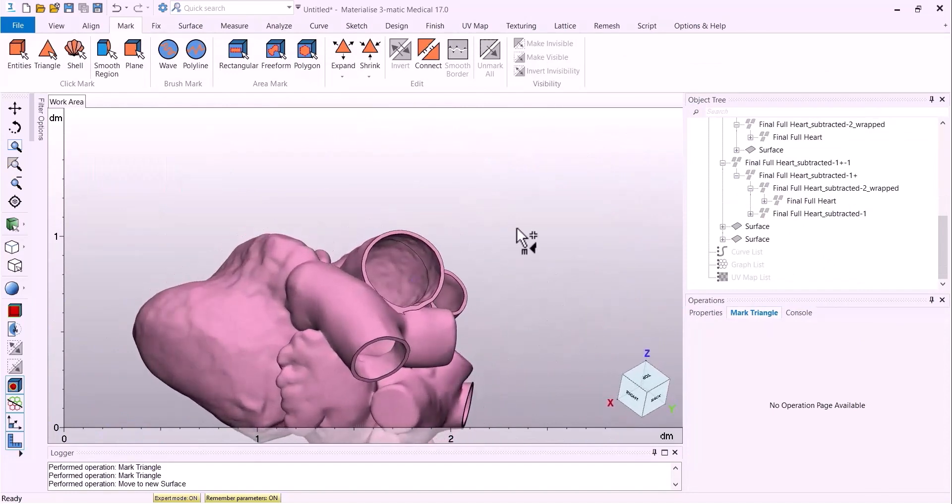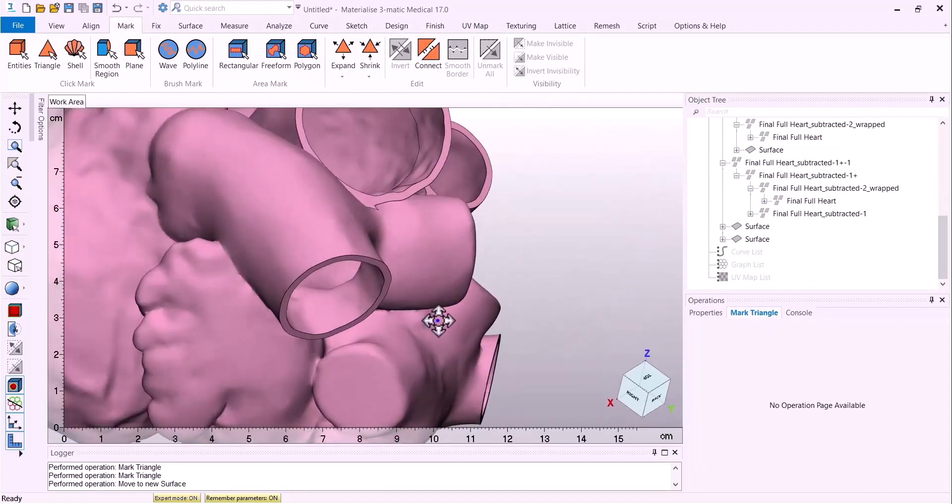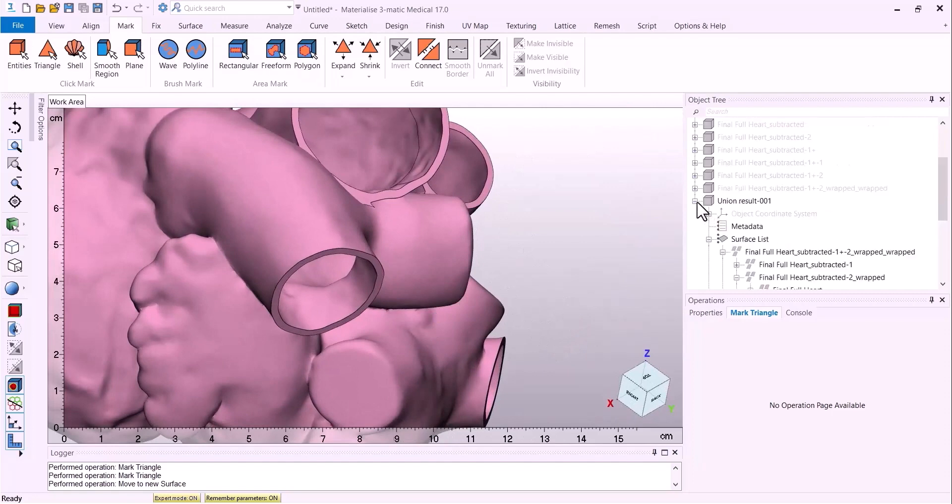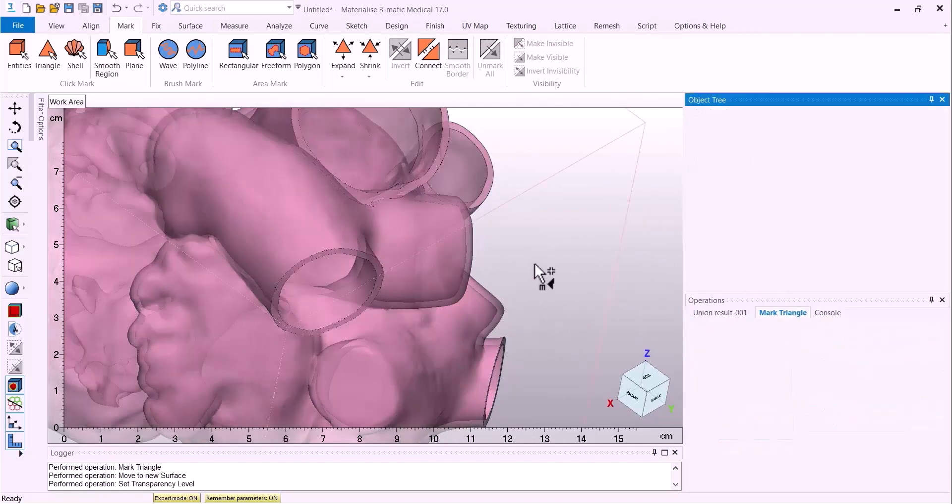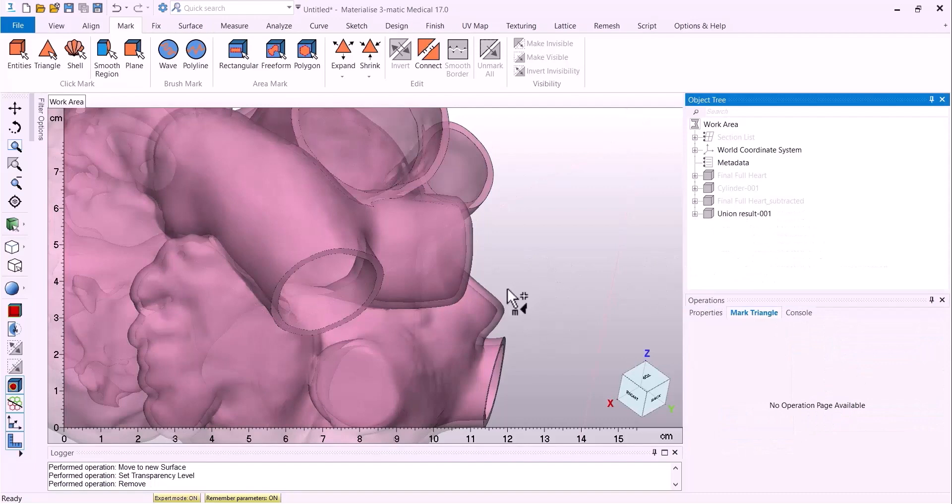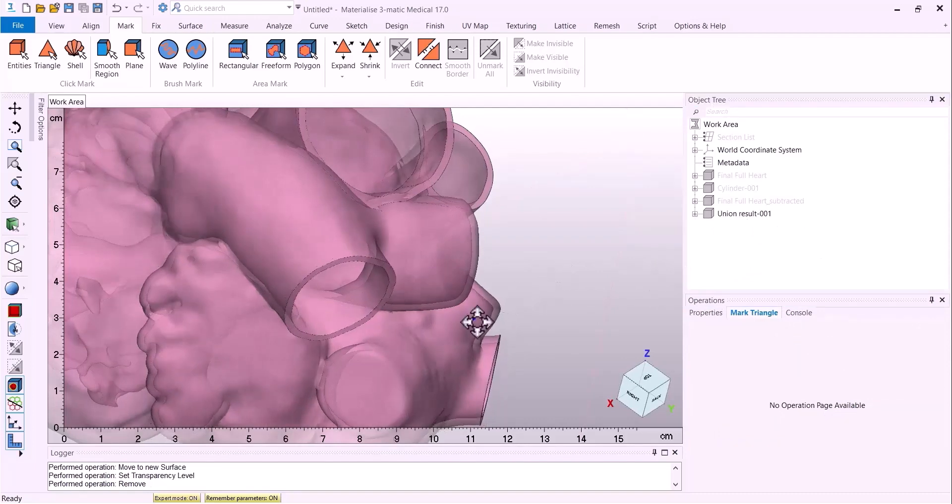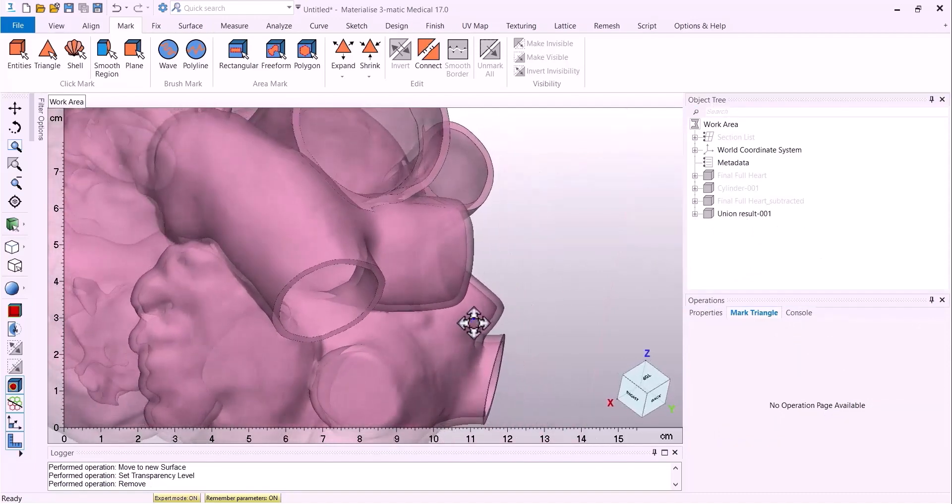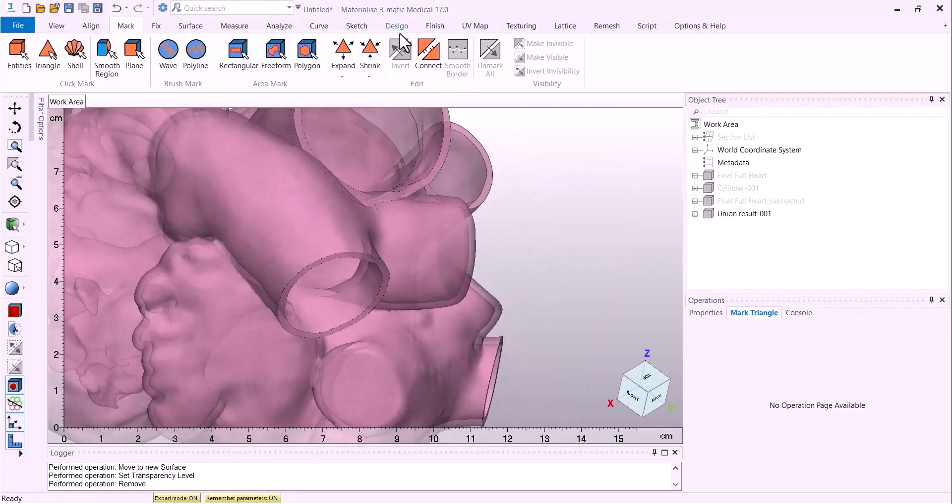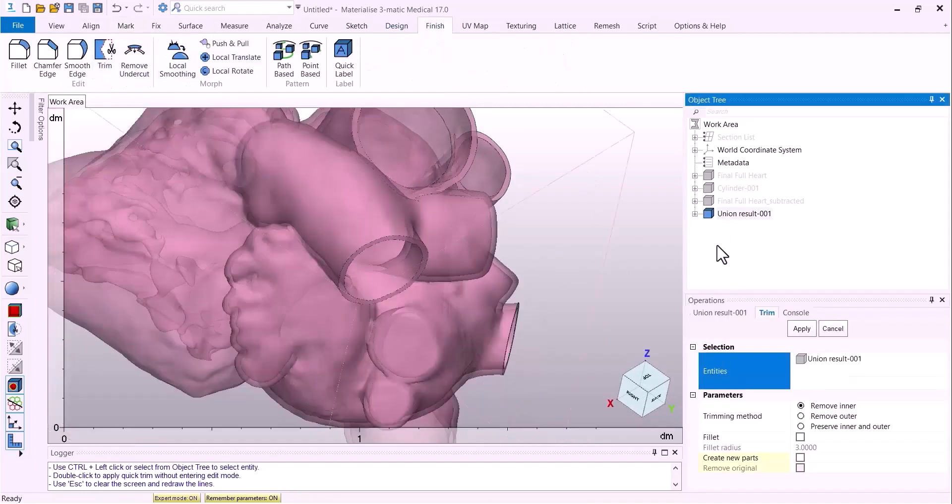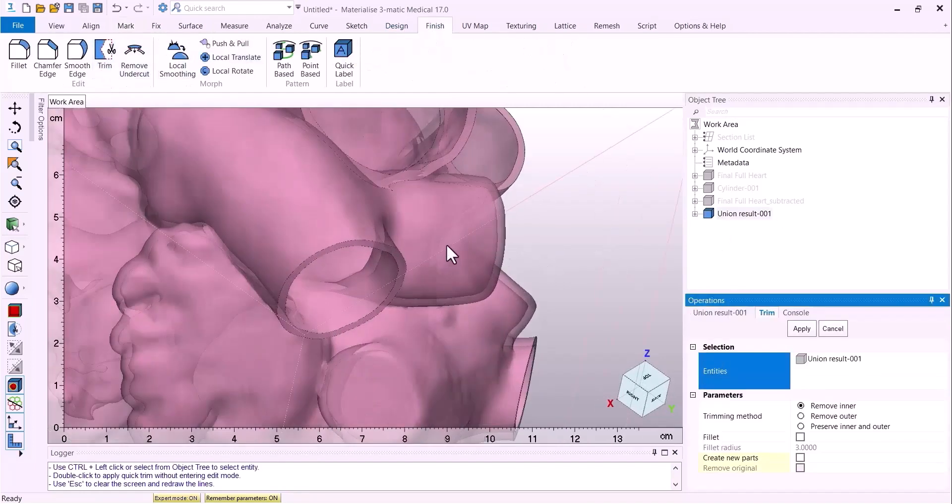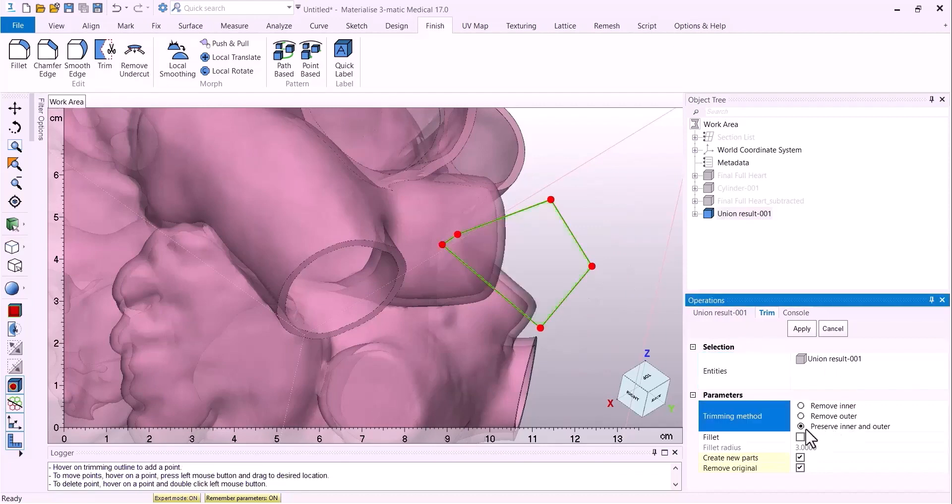Another method to getting to those hard to reach areas is very similar to the first option, except here I'm able to find an angle on the vessel that I want. When I turn on the transparency, I can more clearly see the edges of the vessel that's actually in the back of this view to define the trim section more easily.